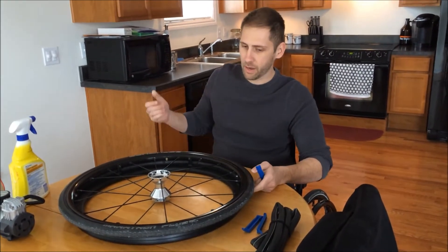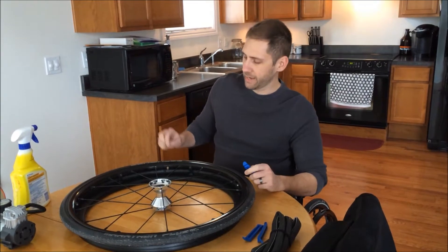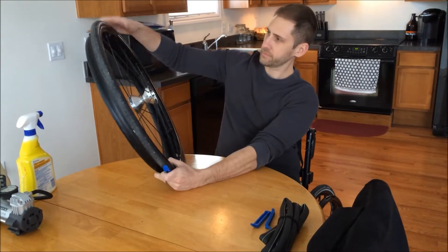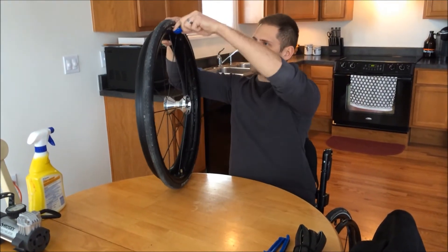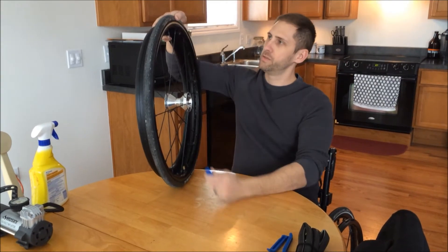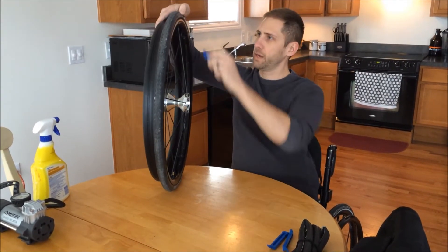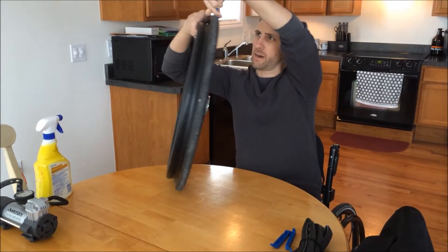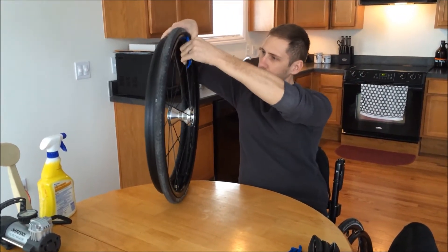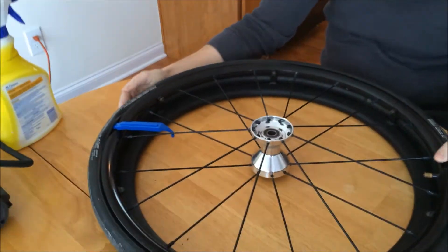So what you want to do is take the tire lever at the opposite end of the valve stem and just kind of wedge it up under the top. These are designed to hook onto the spoke so you can work your way around getting the tire off. You kind of pull that down and hook it around the spoke.